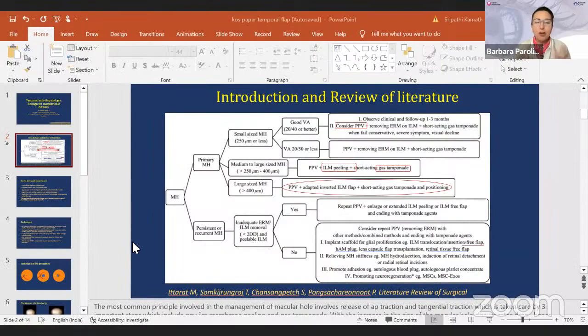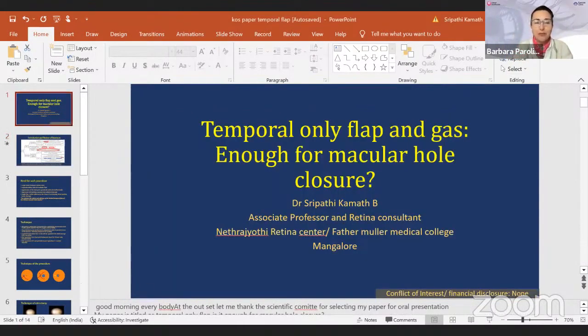We don't have the answer on which one is best, because we need a surface to cover the hole. And you've already said in how many ways it has been tried. But one point is the anatomical improvement, and very different is the functional improvement. If we are not able to really close the edges of the hole in the U shape, we will not have a functional improvement.